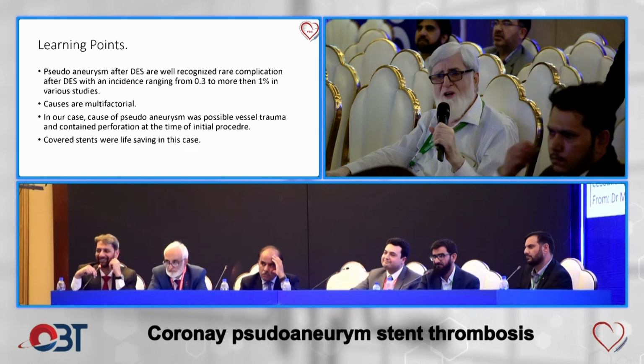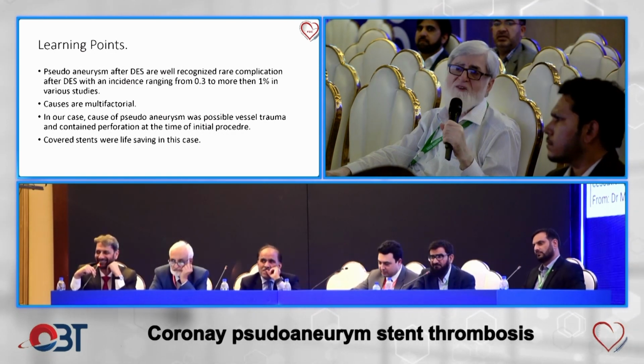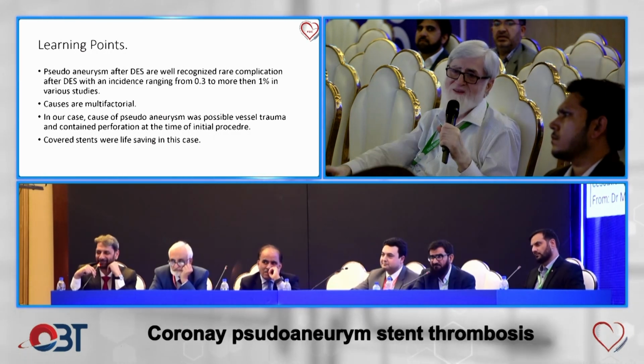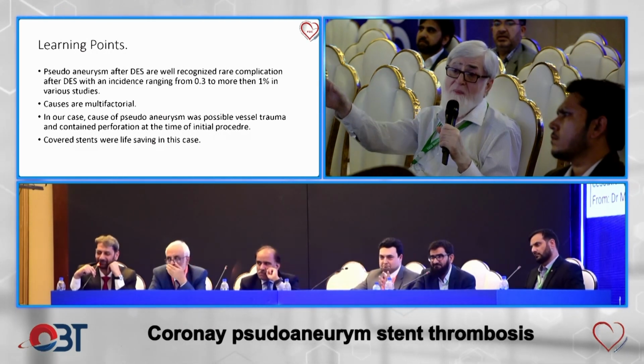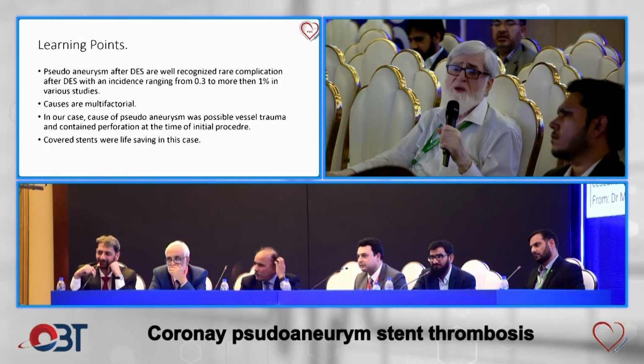I think there was no need for echo even, because the patient was hemodynamically stable. With that much leak, I don't think the patient will be that stable. May not reach the cath lab even. So this was sure that this was not into the pericardial space.